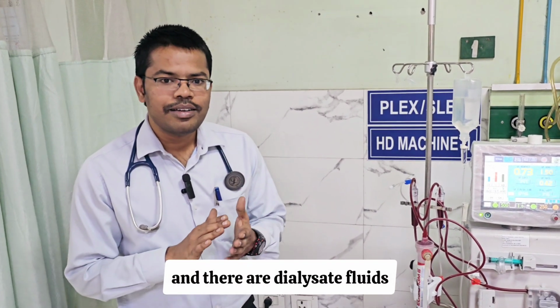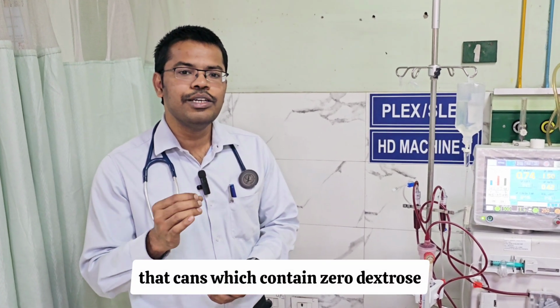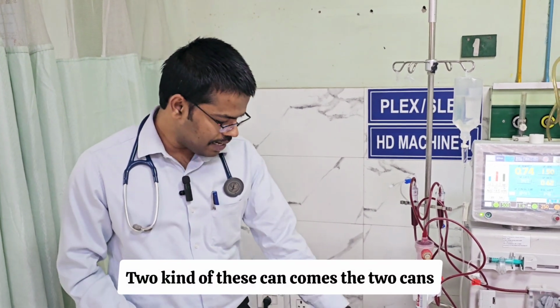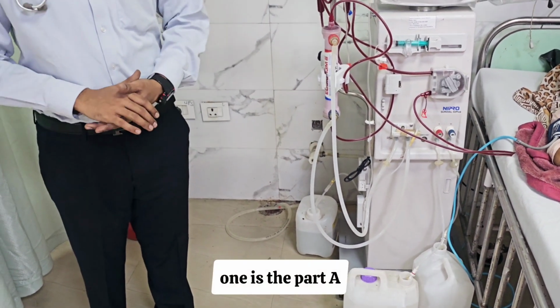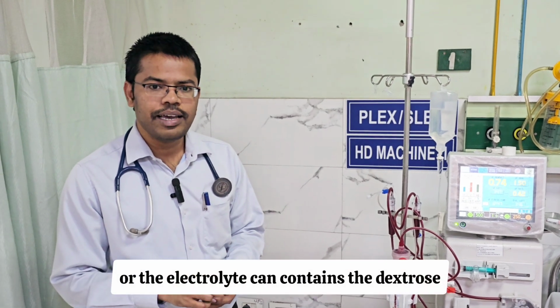And there are dialysate fluid cans which contain zero dextrose. That is called dextrose-free dialysate. Two kinds of these cans come. The two cans which are there: one is the bicarbonate can, another one is the part A or the electrolyte can. The part A or the electrolyte can contains the dextrose. As I told, the other set of can which doesn't contain dextrose is the glucose-free part A.